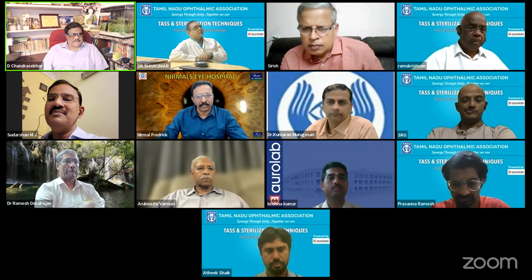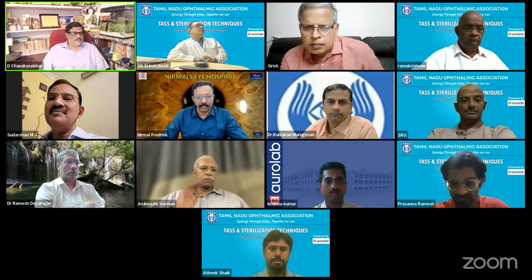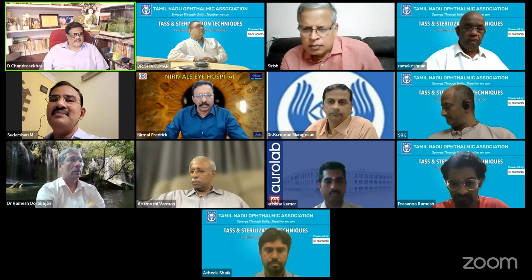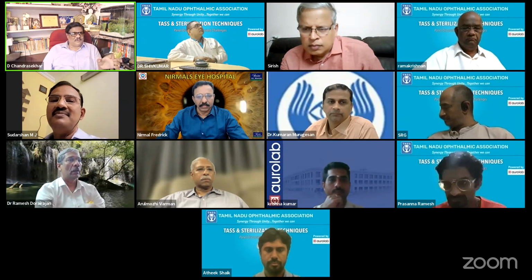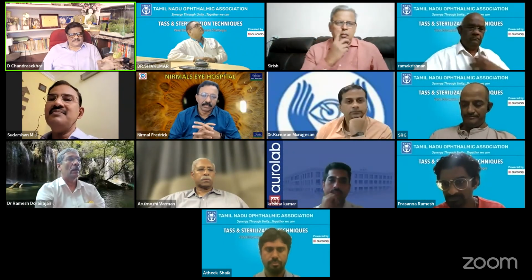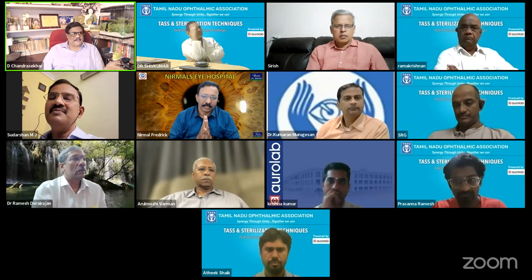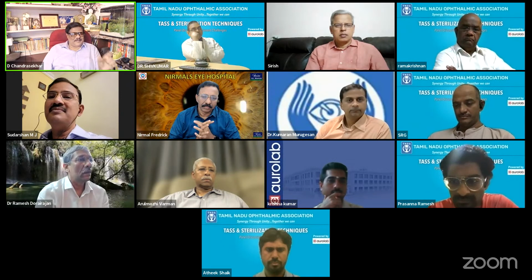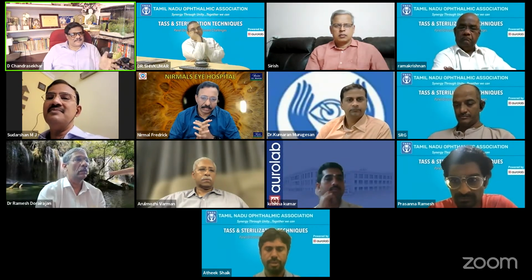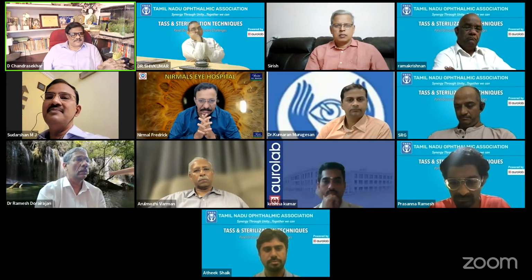Before we go to the discussion on some of the important points, I'd like to narrate my own experience, which is worth talking about in this forum. About 12 years back, I was going to a secondary center in a town to operate phaco. On a particular day, we had operated 25 cases. On day 1, I went to see the post-operative cases. Three doctors were operating. We had about 15 cases with corneal edema. Anterior chamber reactions were with fibrinous membrane, some with exudate, some with very minimal iridocyclitis.